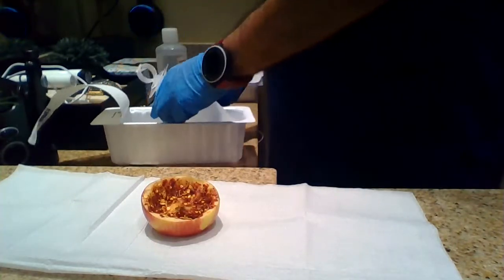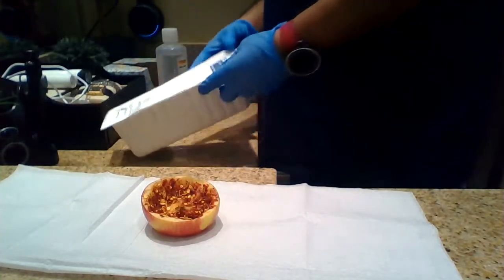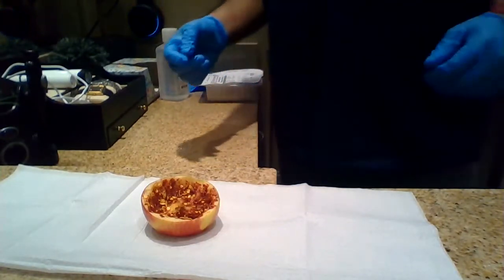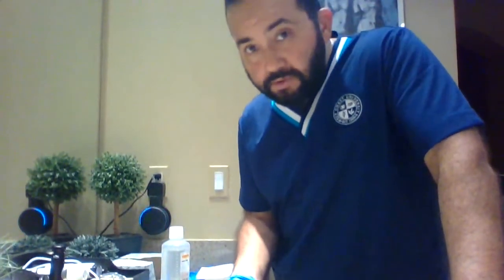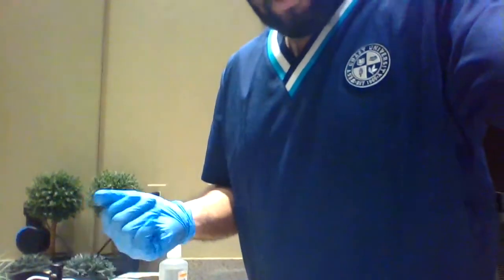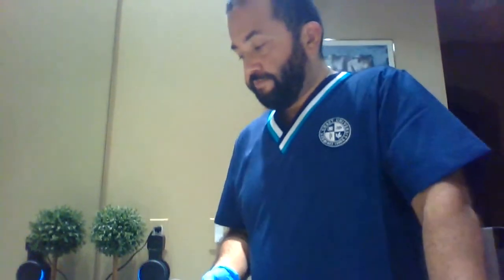So now that we're done irrigating, before we put it away, we would actually obtain a specimen sample for the lab. And one thing with specimen samples, label correctly.